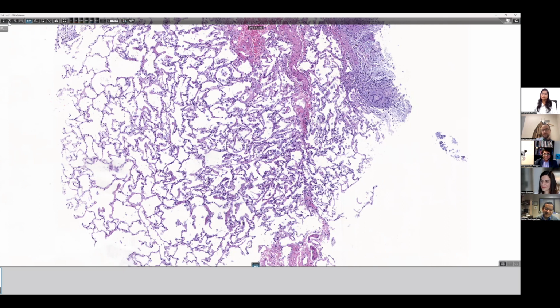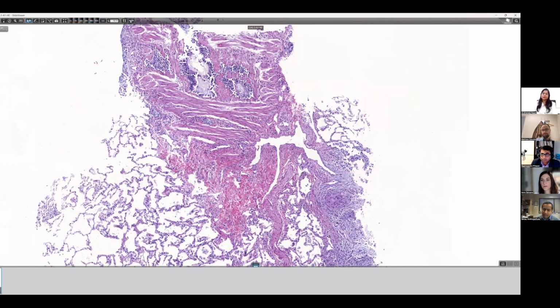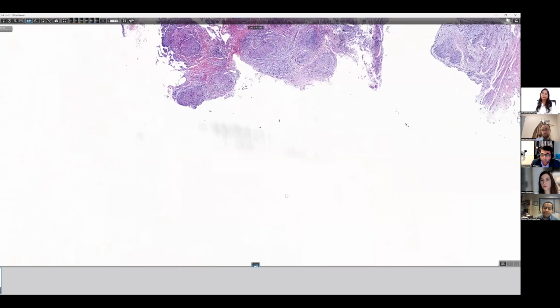Yeah, I agree. I just deal with it in my comment. I just say that the morphology favors sarcoid, but it's a diagnosis of exclusion, and other rare causes must be excluded, whether they're on some rare drug or something. To me, it's a clinical pathological correlation that sorts that out. So in my case, there was no malignancy in the adjacent lymph node. The entire lymph node was showing sarcoid granulomas. There was no malignancy in that.